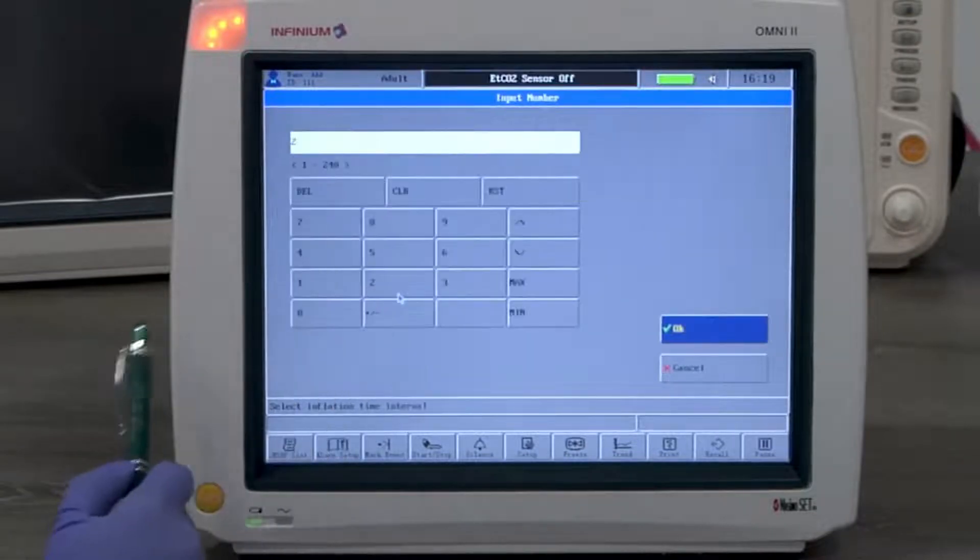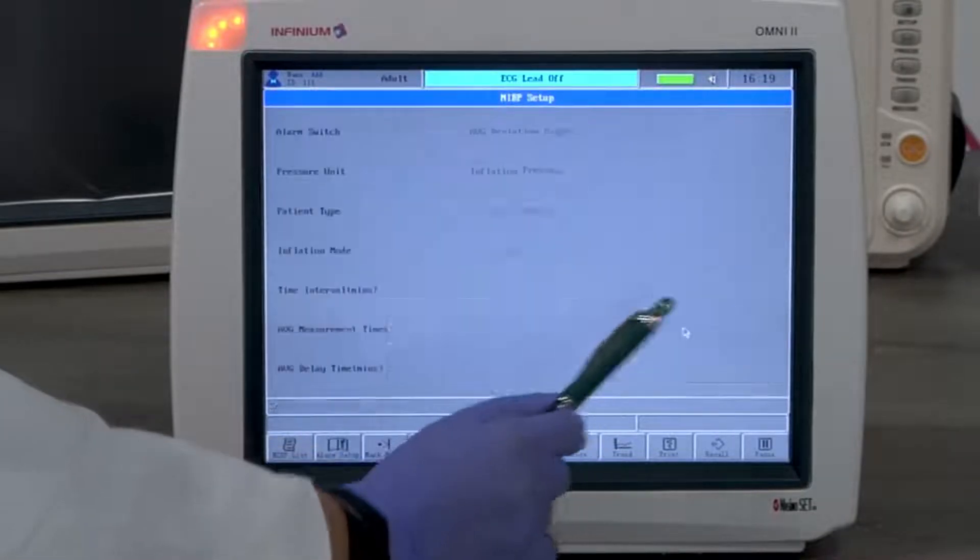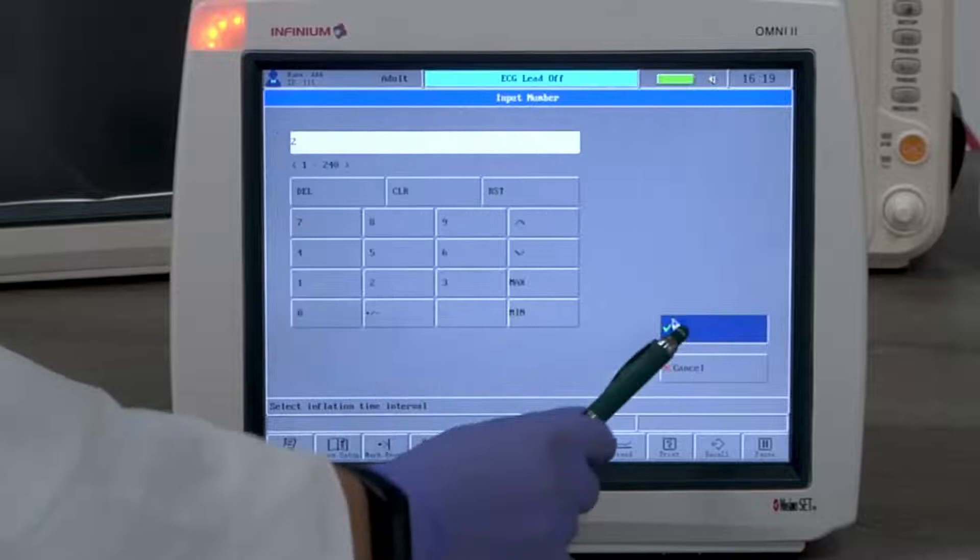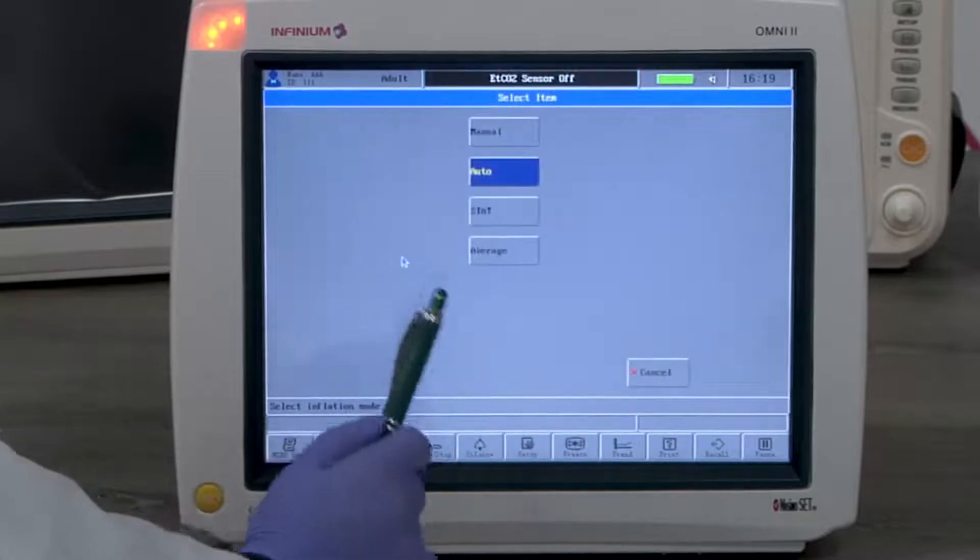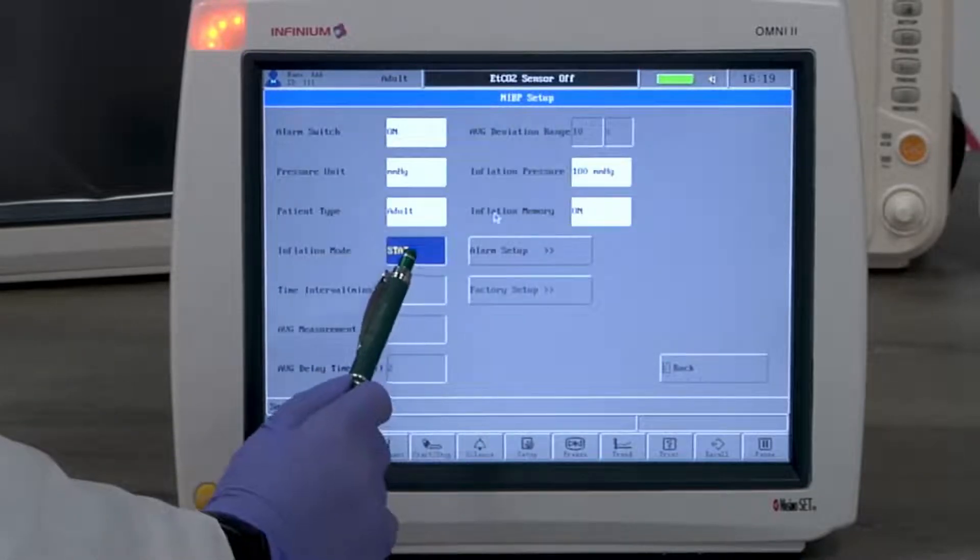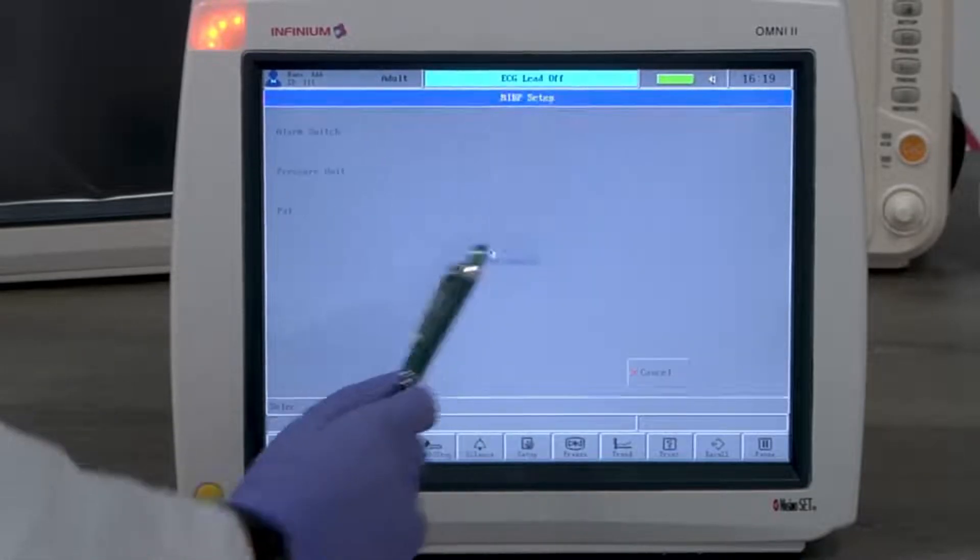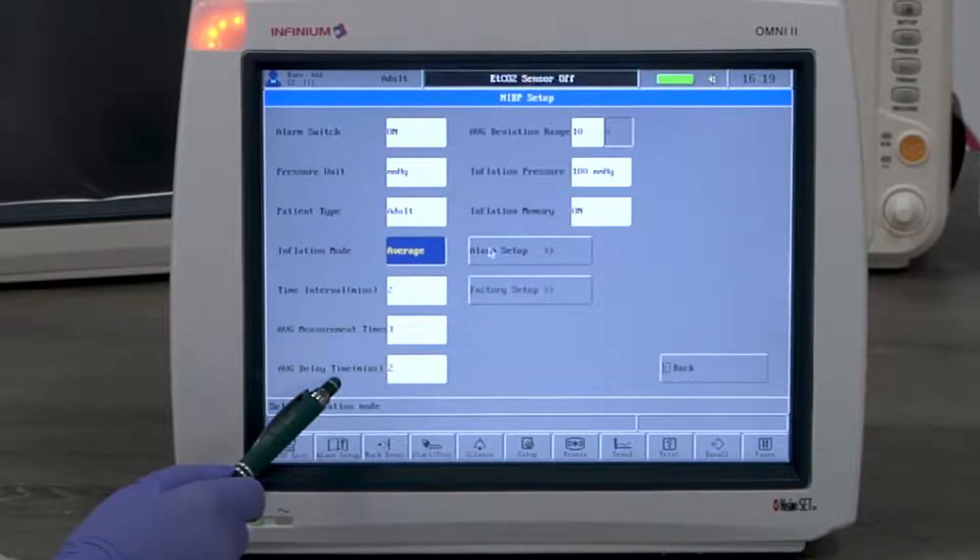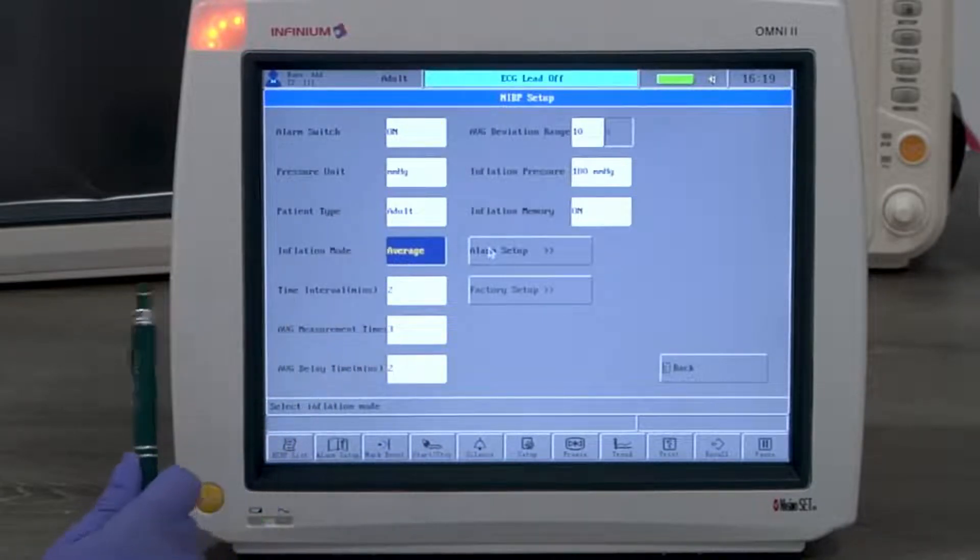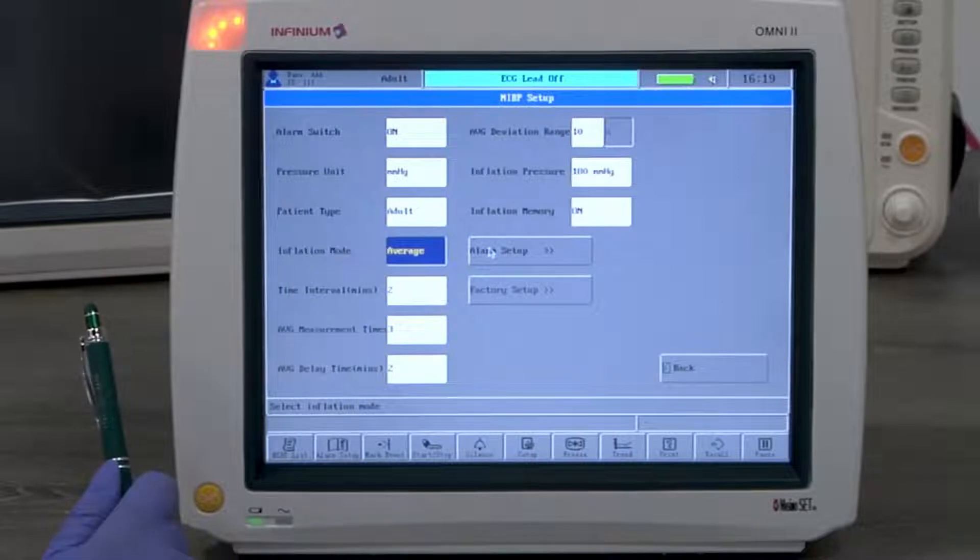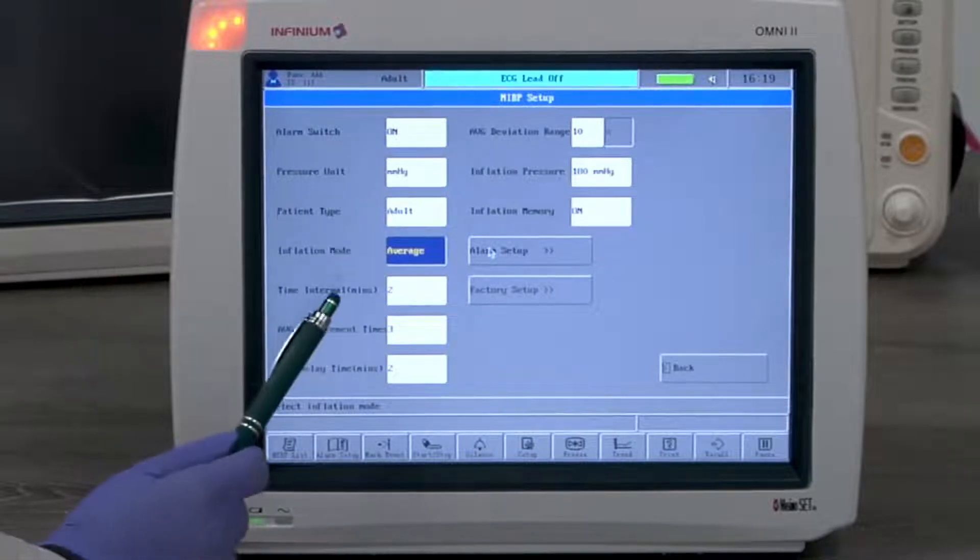Stat mode takes three measurements when you give a command. Average mode takes multiple measurements with the delay time set between each measurement and displays the average results from these measurements. Another set of measurements start according to the set interval.